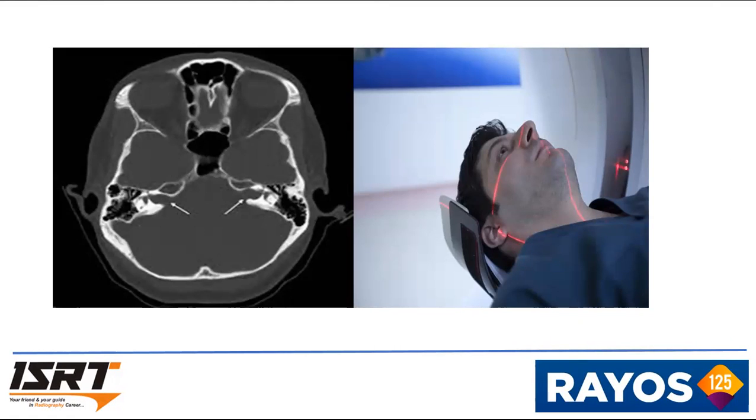Whether in CT or in general radiography, positioning of the patient and part are very crucial for obtaining an acceptable image of diagnostic quality. While performing a CT head, always try to position the patient maintaining symmetry on either side by carefully positioning the laser localizer. The laser beam has to pass through exactly the same points on either side of the head. So position the patient's head in a symmetric way as far as possible. In some cerebrovascular accident or traumatic patients, you may not be able to position the patient exactly symmetrically, but you try your maximum to position the head in a symmetrical way.